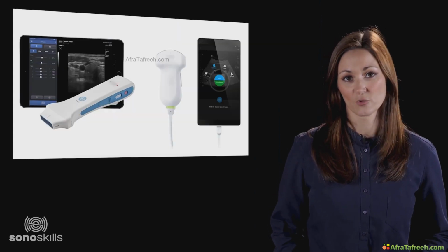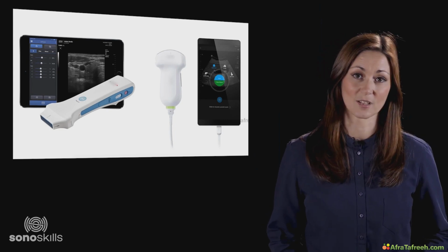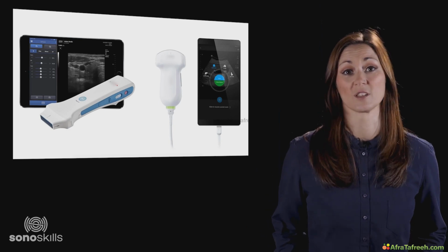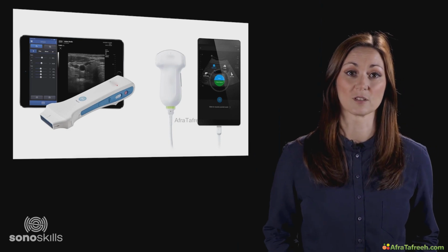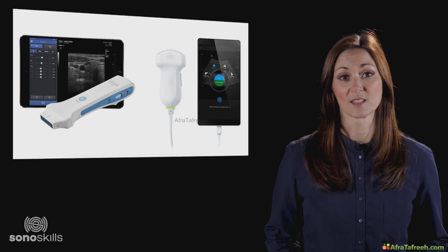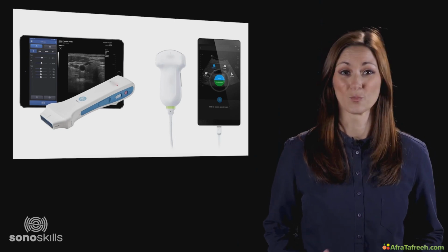Smart device-based ultrasound devices are innovative with interesting pricing and an interesting future. The quality among these systems differs quite a lot. The general quality is good enough for the bigger anatomical structures and all bigger pathologies. The devices still have limitations when it comes to smaller anatomical structures and/or smaller pathologies.